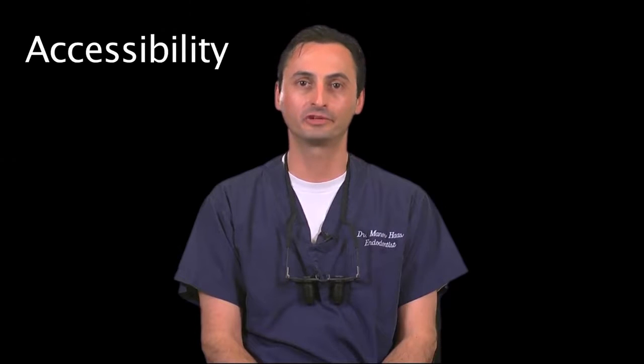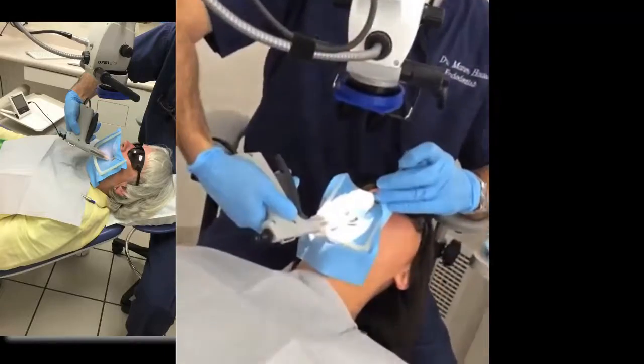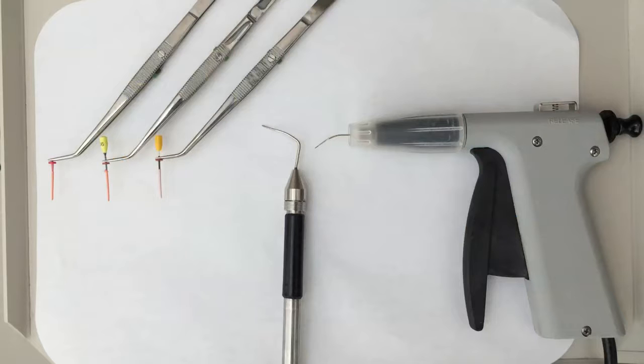Now, most root canal treatments are performed on posterior teeth, which are often more challenging to reach because of the opposing arch or the patient's limited opening. With that in mind, I would like to mention that from a practical and clinical perspective, it's not just about getting warm 3D obturation of the root canal system, but it's just as important to evaluate if your warm obturation system can enable you to obturate with ease in difficult to access areas.